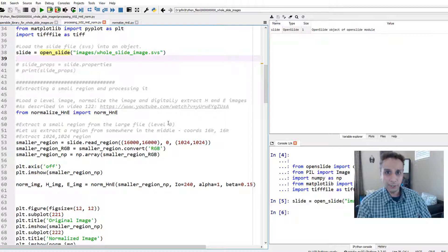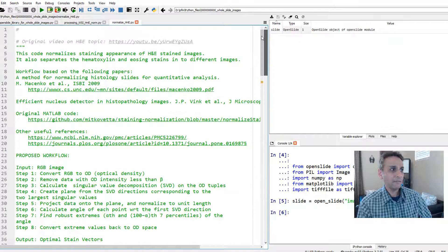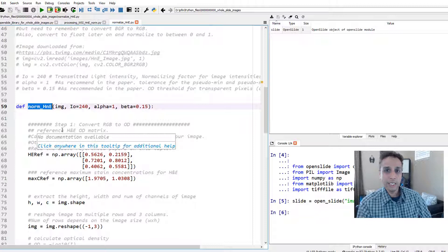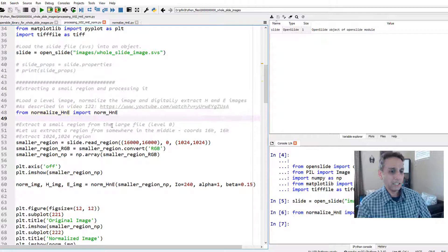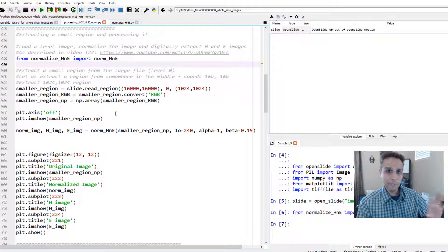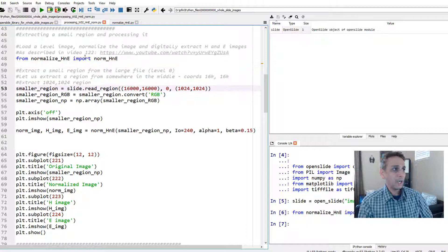From my normalize_HnE file — the one I created to normalize our H&E images — I'm going to import the norm_HnE function. Let's run it. That part of the code is loaded and ready for us to use.